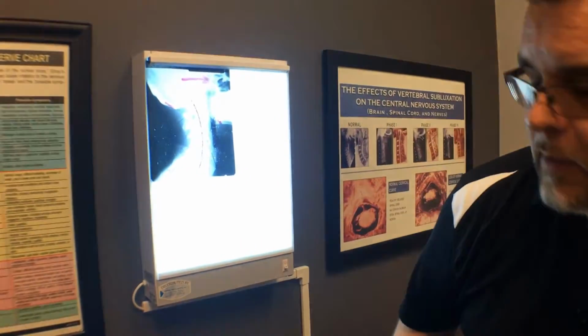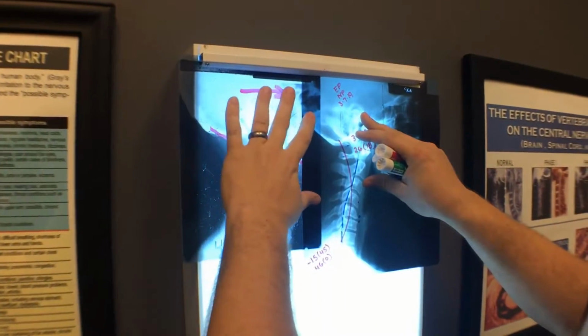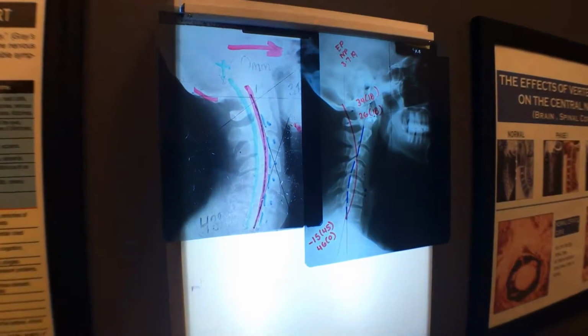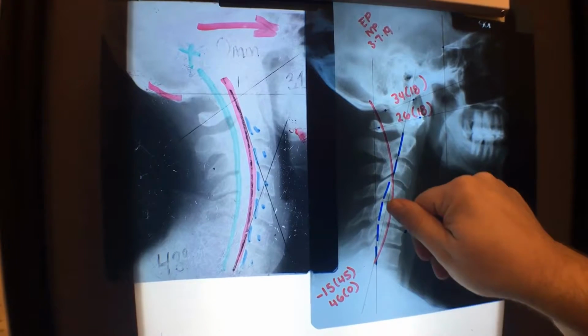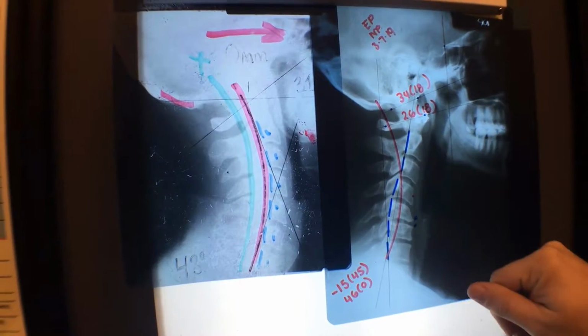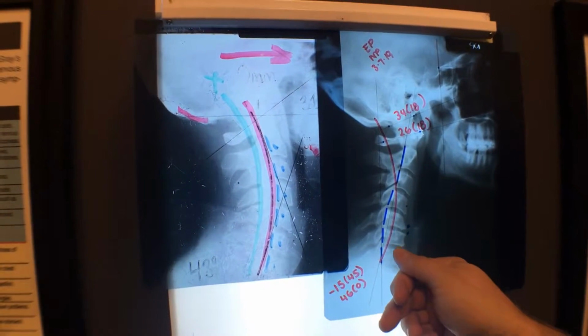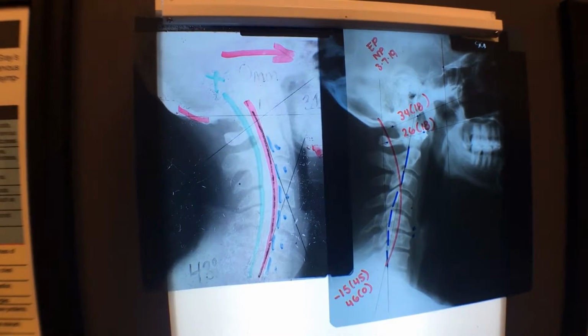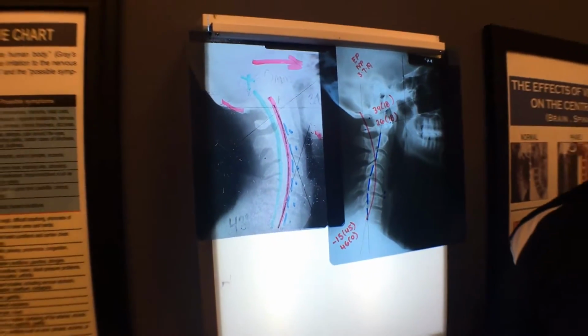So let me show you about a patient who came in recently that was having a lot of issues with headaches, a lot of issues with some throat things, and I'll show you what's happening. So this is an x-ray of somebody, and we'll compare and contrast these two. So if you guys can see this, do you see the difference of what's happening here? You see how there's a red line here. This red line is normal, and this blue line is where this person is. So if this red line is normal and this blue line is where this person is, you can imagine what that does to the spinal cord inside. And you can actually see the spaces are changing. There's bone spurring and lipping starting in this area. So that's definitely not good on an x-ray. It's also not good to their health.